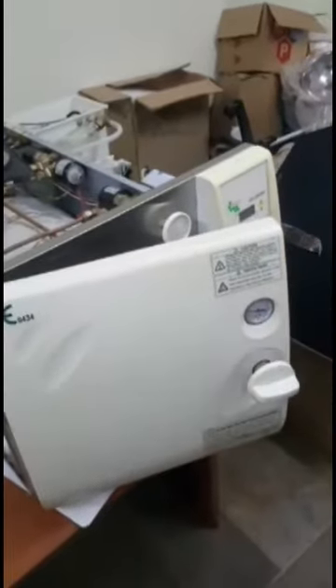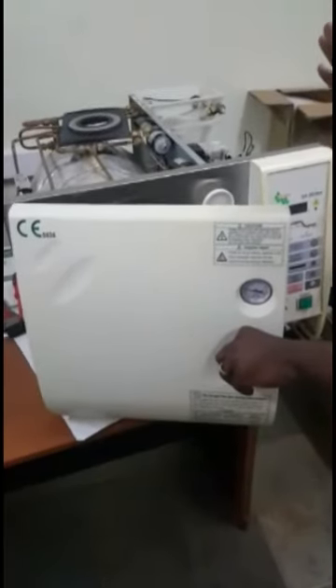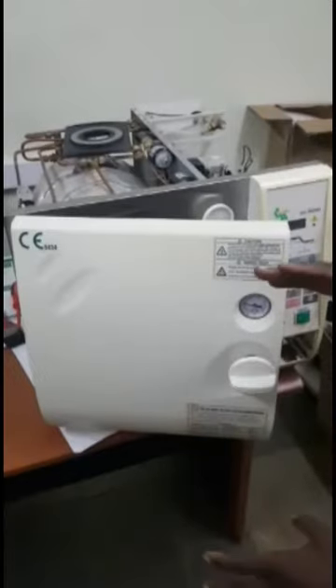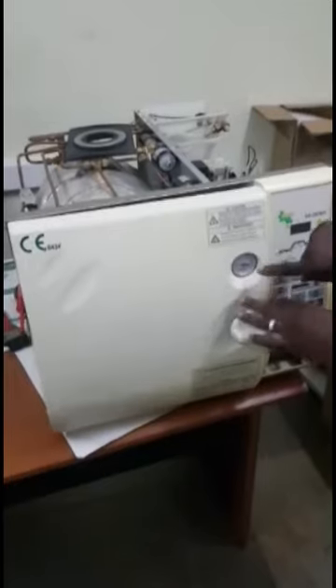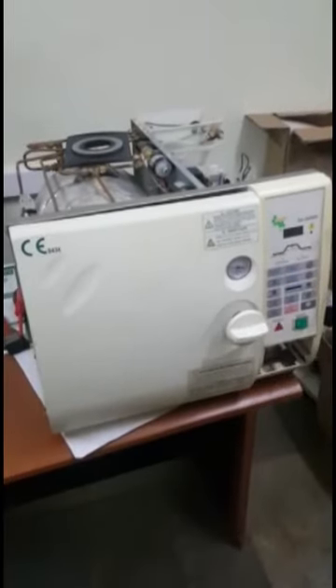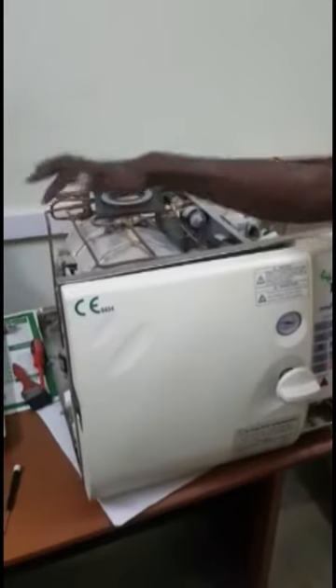Another thing is this gauge. Sometimes the pump will be sucking in but the pressure gauge will not respond, or it will get stuck and remain there for a long time, then move all of a sudden. When that happens, it is a problem because if you don't have the pressure gauge working, you will not be able to know whether the pressure inside and outside is balancing, or even if there is an over-pressure in the chamber, probably as a result of failure of the pressure regulator.